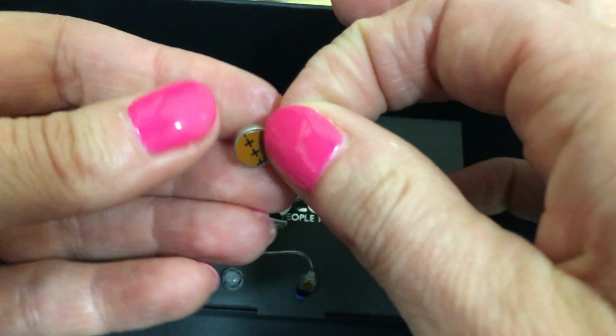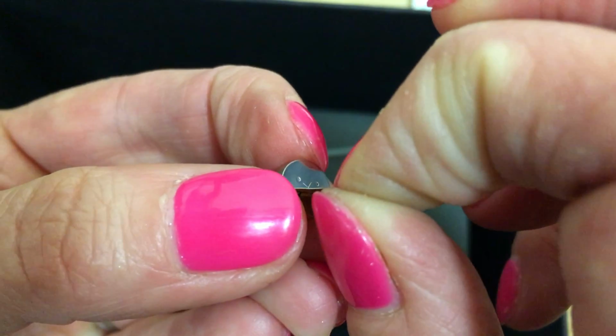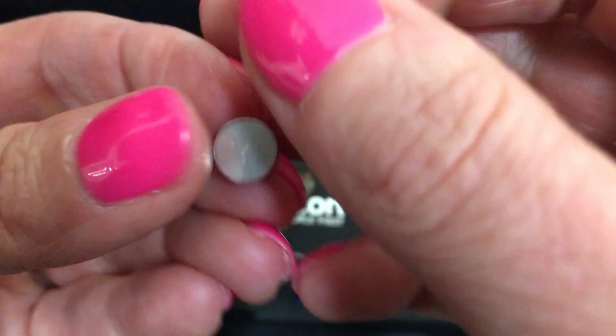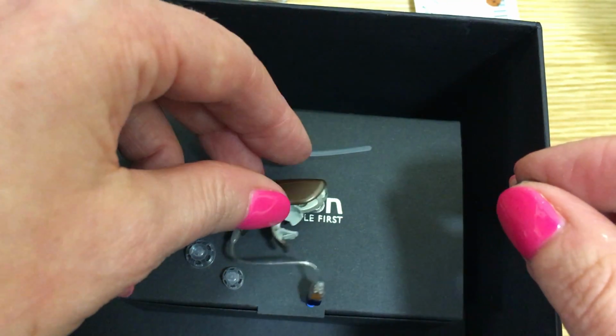These are zinc air batteries, which means they are almost inactive until we peel the sticker off. There are pores at the top of the battery which allow air in. Once air enters these pores, it activates the zinc, which then activates the battery.